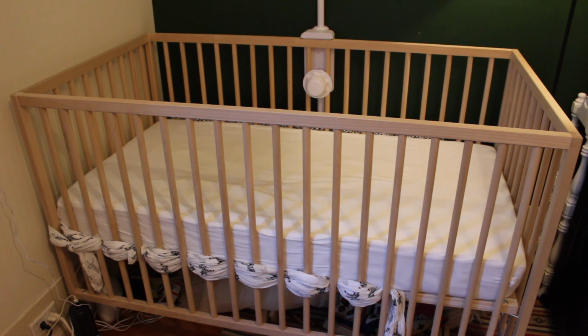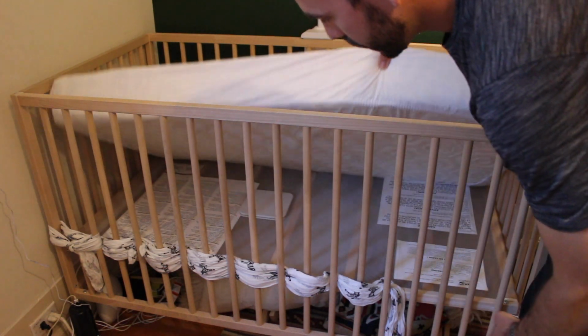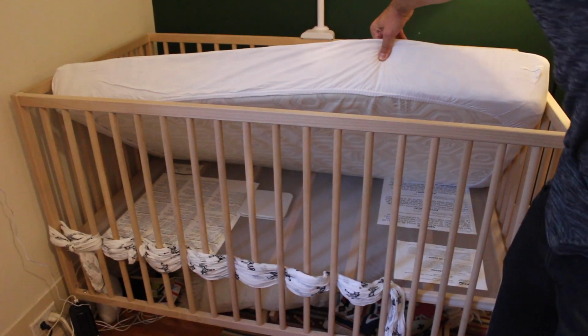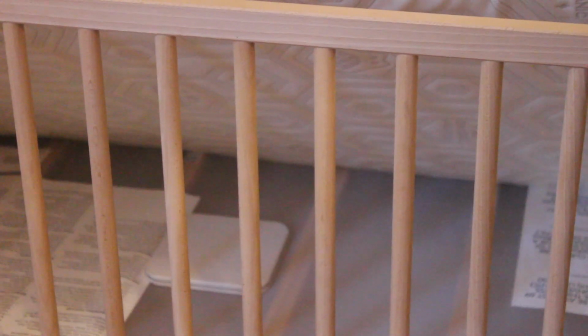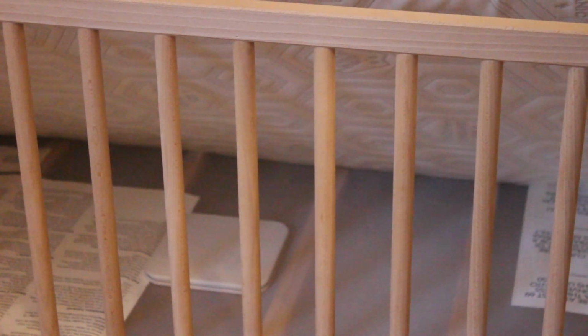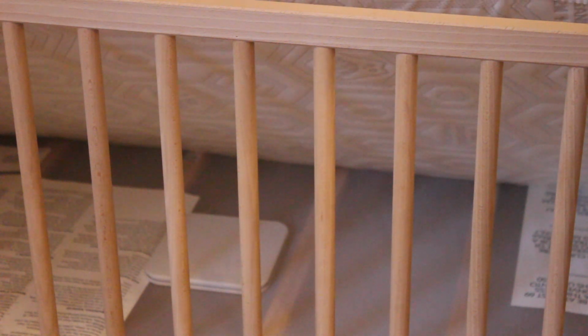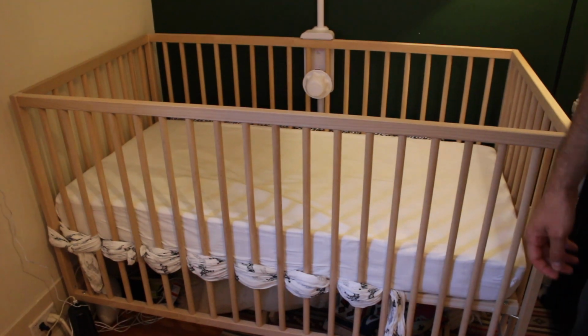So I just wanted to give you a little demonstration of the setup of the Angelcare monitor, starting with the breathing monitor. As I lift up the crib mattress here, you'll start to see under there, and I'm just going to zoom in a little bit so you can see it. So there's the pad, the breathing monitor, and it just sits down there on the crib platform. And Angelcare provides a piece of wood, essentially, that you can also purchase on their site, that would lie underneath if you don't have something stable underneath your mattress that it can sit on.